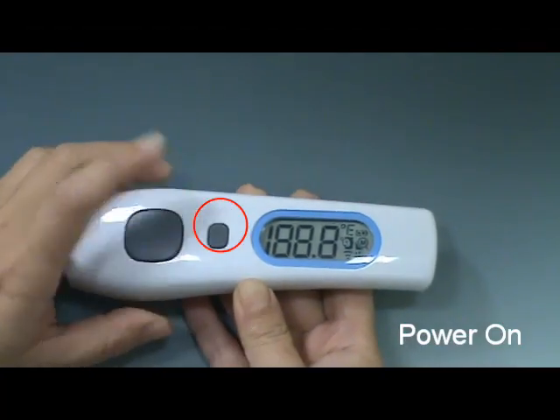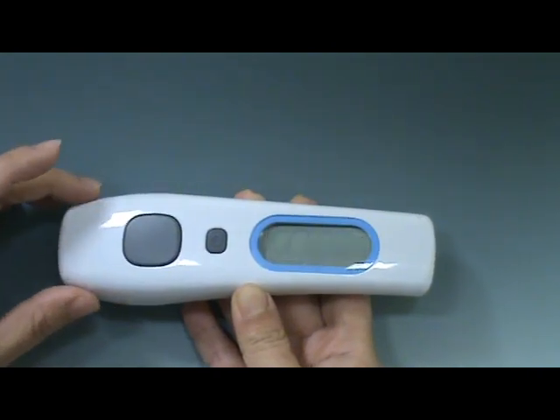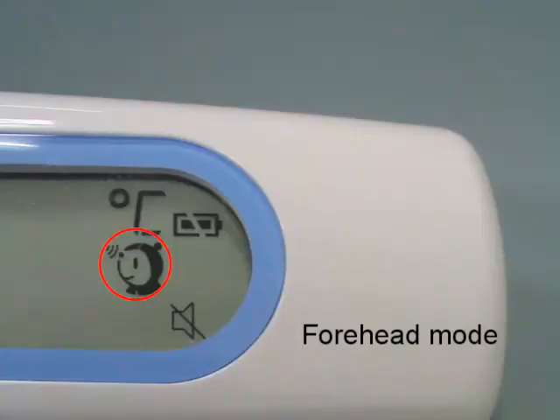Press the main button to switch the thermometer on. The thermometer performs a brief self-test. All elements of the display are shown on the screen and you can hear a 2-beep sound.